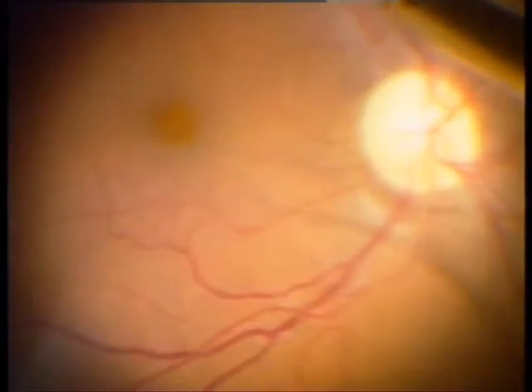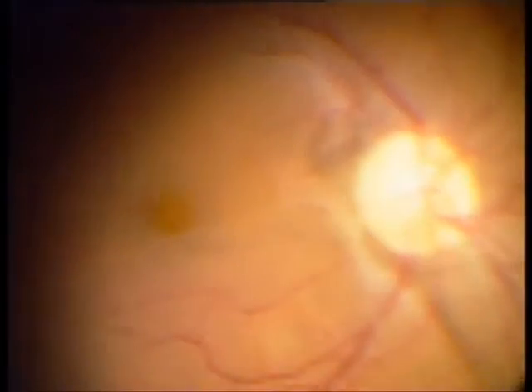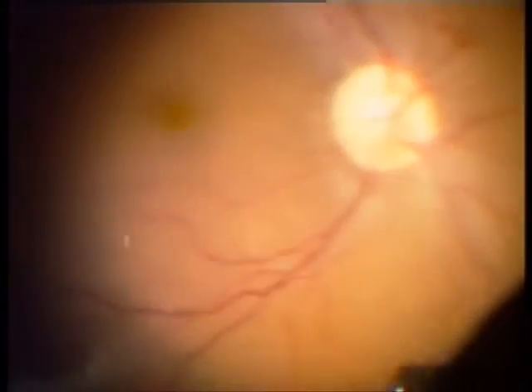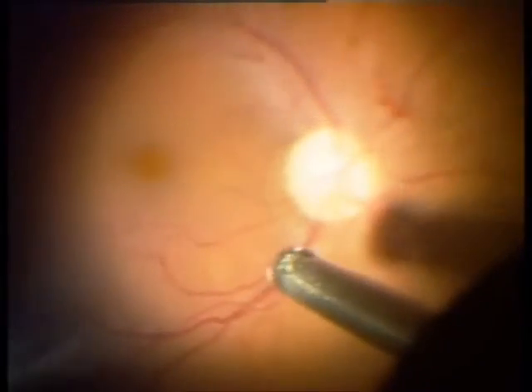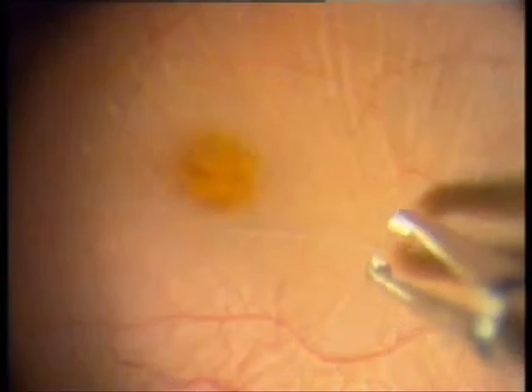You can see the edge of the thickened hyaloid and the shadow created by it while we are pulling the hyaloid. After this, the detached hyaloid is removed using the cutter.